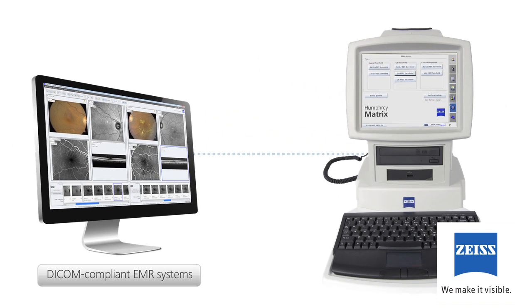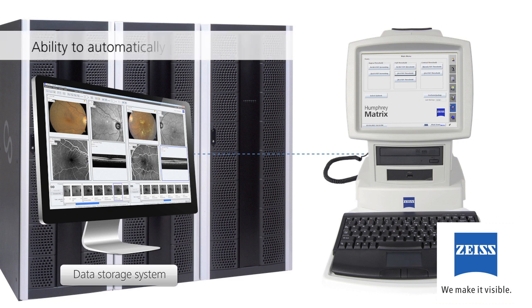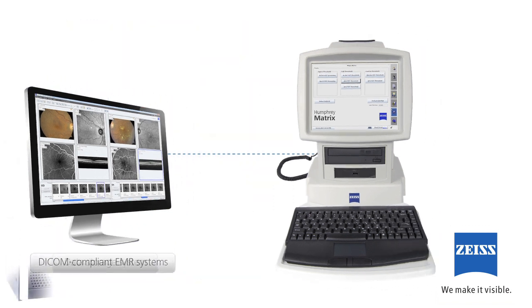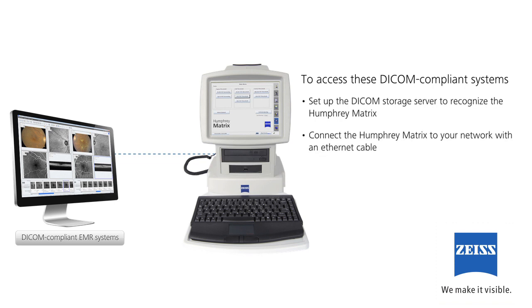Your Humphrey Matrix 800 can be connected to a DICOM compliant data storage system such as Zeiss's Forum. Connection to such a system can streamline workflow, including the ability to automatically pull up existing patient data prior to a test, eliminate duplicate patient entries, and access identical data from all participating test modalities in numerous locations throughout the office. To access these DICOM compliant systems, set up the DICOM storage server to recognize the Humphrey Matrix, connect it to your network with an Ethernet cable, and configure the DICOM gateway feature.